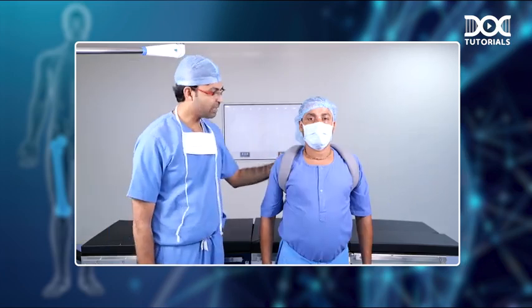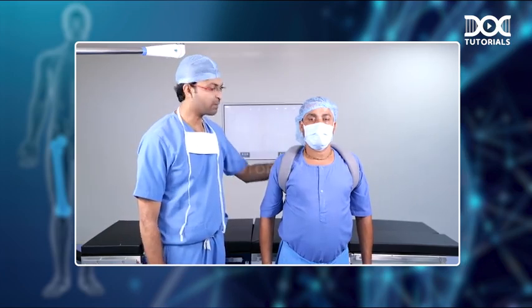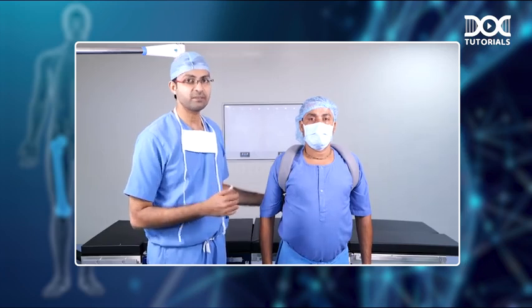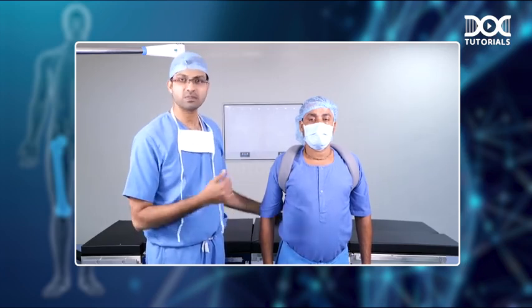Now this is how the figure of 8 brace will look from the front, and many a time this is the picture that you will get for your exam. Because this has been asked as a spotter previously.